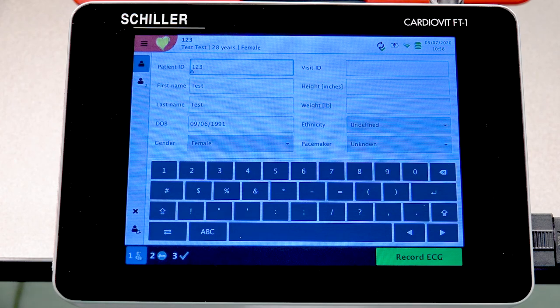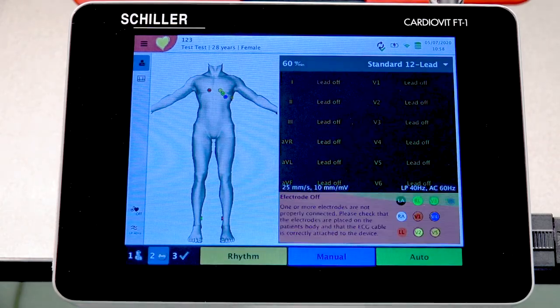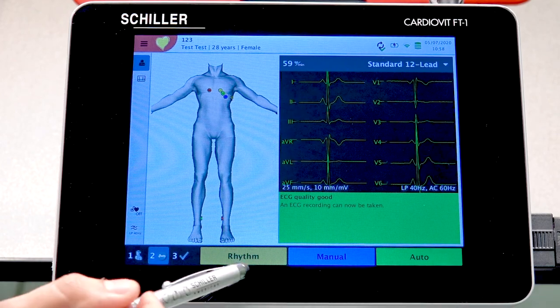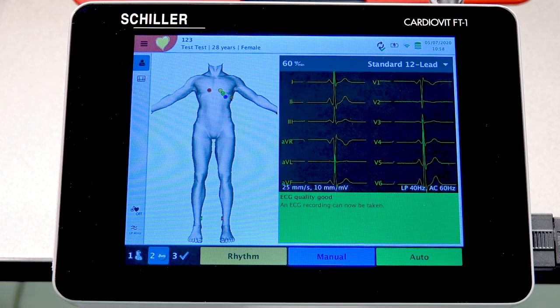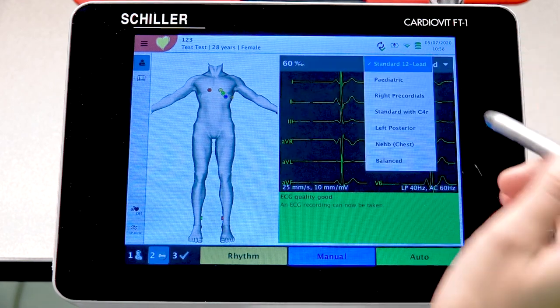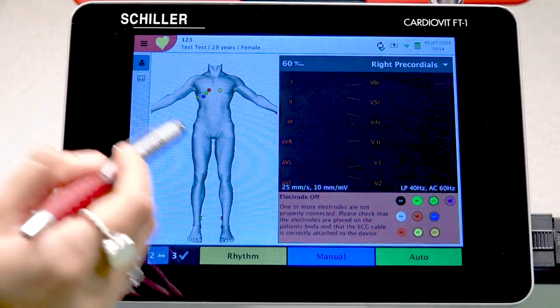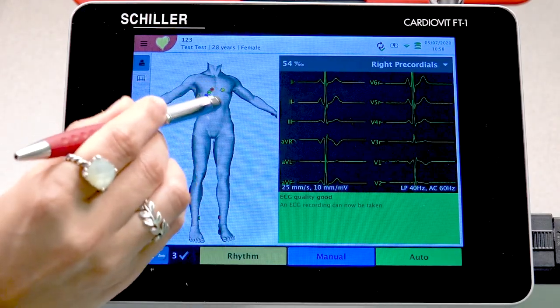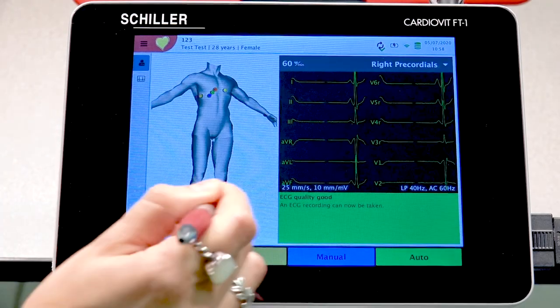Now we'll go ahead and select Resting ECG. One thing to point out is that the nurse or doctor also has the option to select different electrode placements to view different parts of the heart. As you can see, the electrodes move from one side to the other — a nice feature. Let's put it back to standard 12-lead.